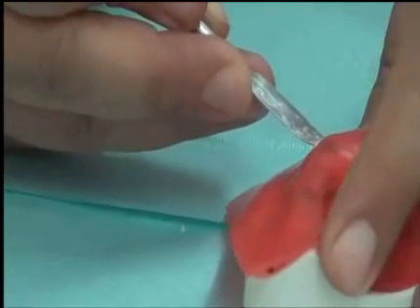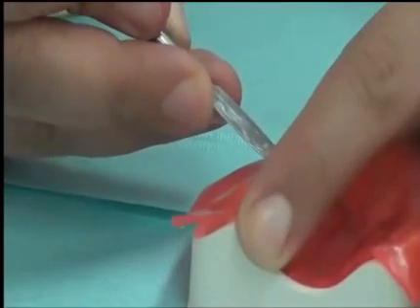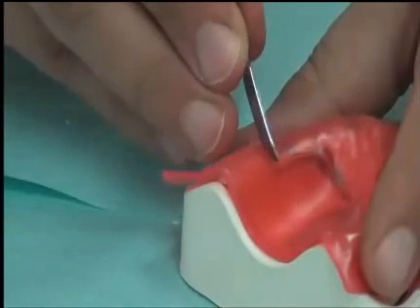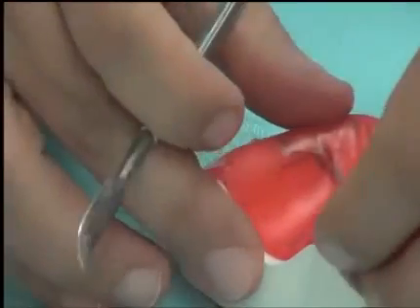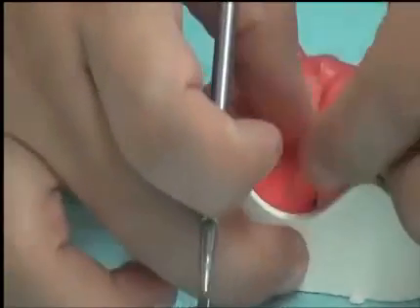So wherever I feel I might have a notch in the outline of my wax, I go in till the end, stop at the tuberosity area, and I'm going to remove the rest. Separate the rest.